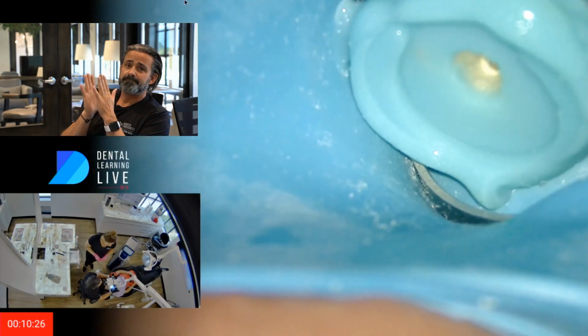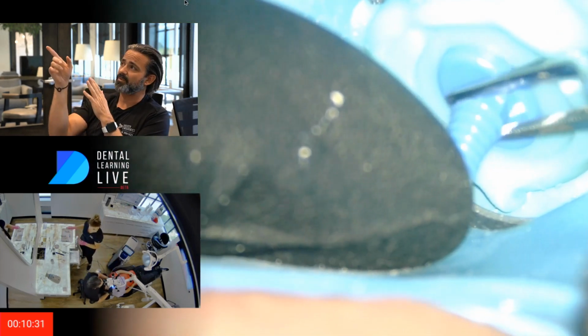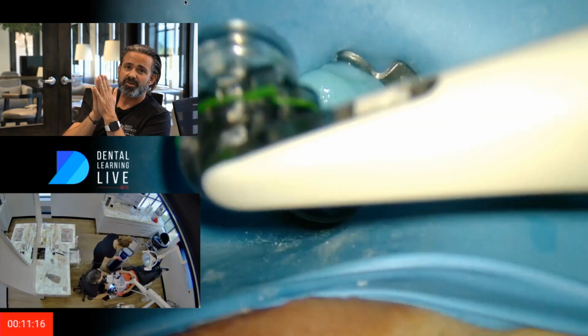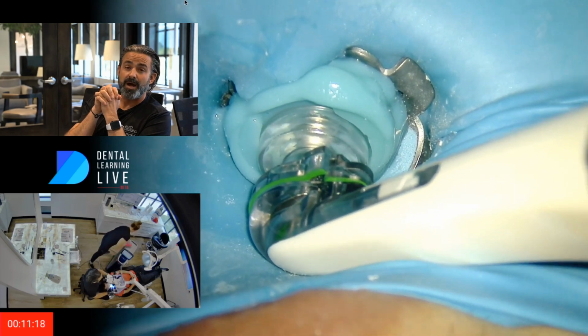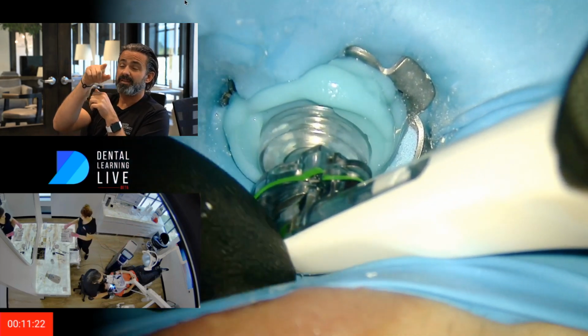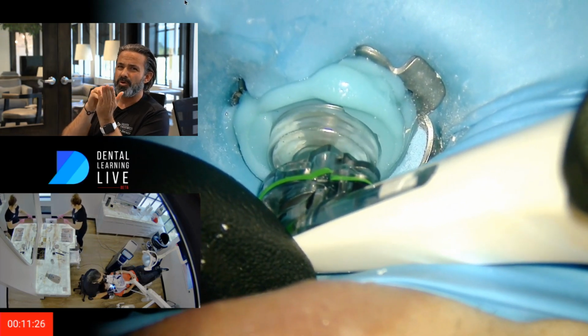And now that that's built, I'm 10 minutes, 29 seconds in, and what I'm doing with these little colored depth gauges is I'm trying to scratch and feel the bottom of the floor. The last one that I used, I went red, then I went blue. And if you notice, this is a green cap because the blue barely touched.